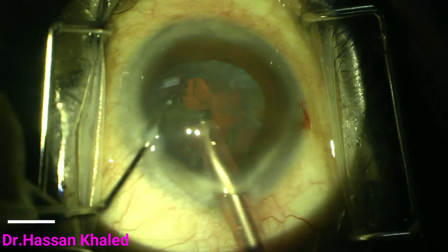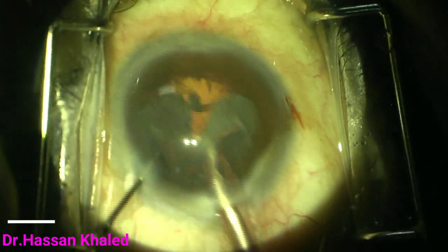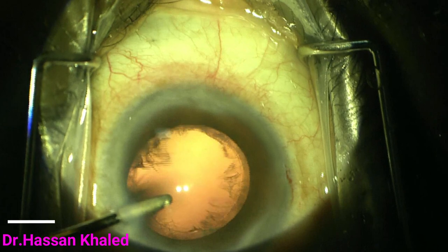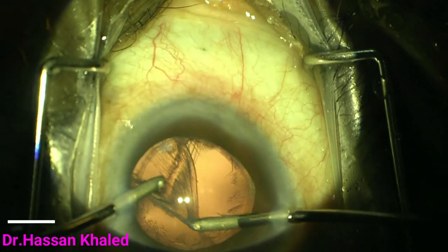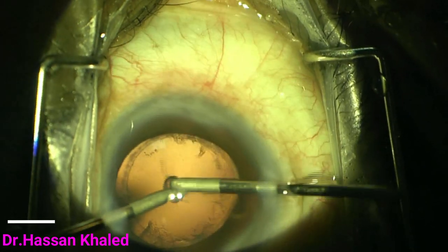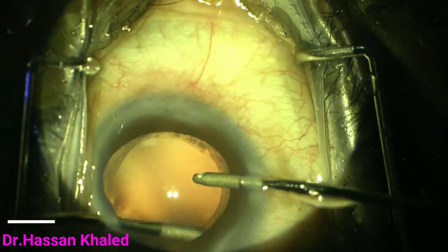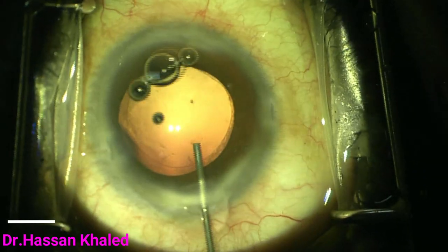With the chop technique, we apply much less force against the zonules because the phaco tip secures the nucleus and the manual instrument forces are directed against each other. Also, the phaco power is reduced by this technique, the stress on the zonules is reduced, and reliance on the red reflex when you have a dense brunescent cataract is also decreased.